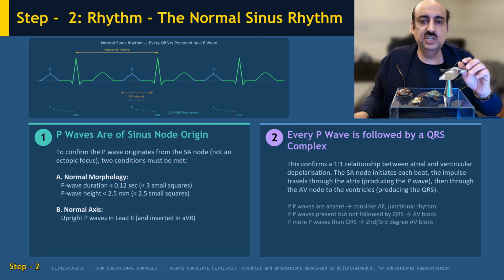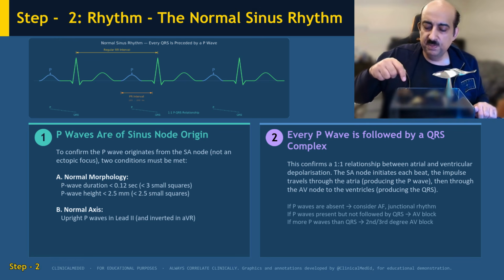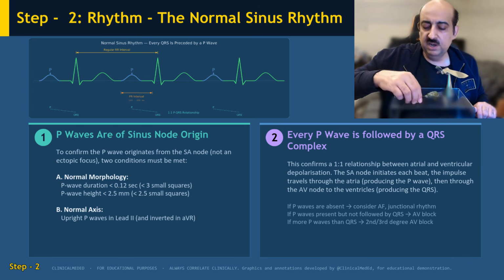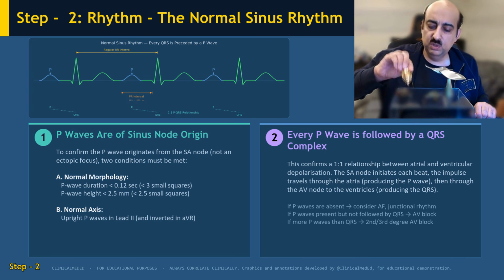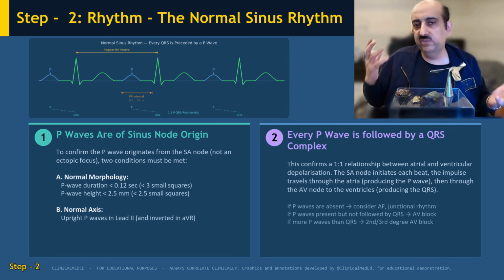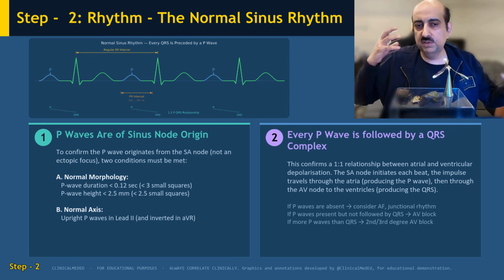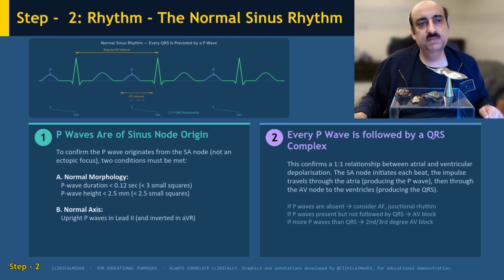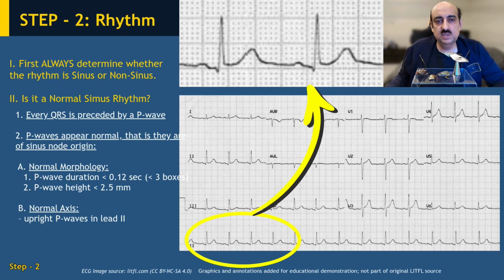And remember our argentum dove from the MedEd quartet. So those of you who have not met before, it's a techie beetle, bready turtle, gold or AU beetle, and my nice argentum dove, which means the balance. So this argentum dove is reminding us of the balance of the atrial and ventricular synchrony and the normal sinus rhythm.